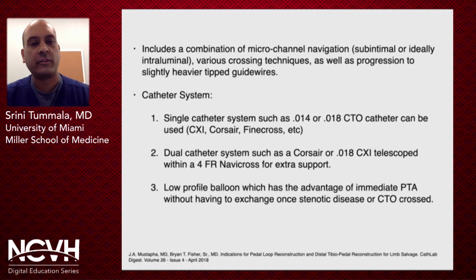And finally, you can also use a low profile balloon as your catheter so that once you've crossed, you can really perform an immediate angioplasty without having to do several exchanges.